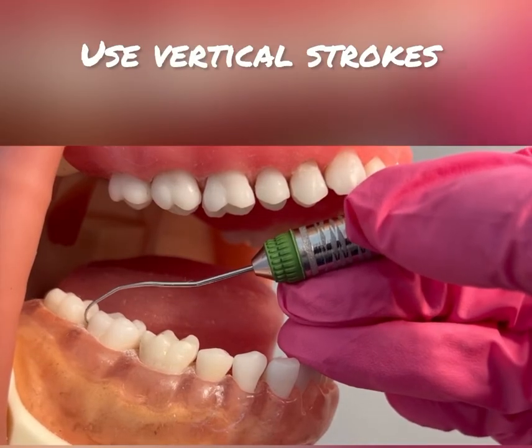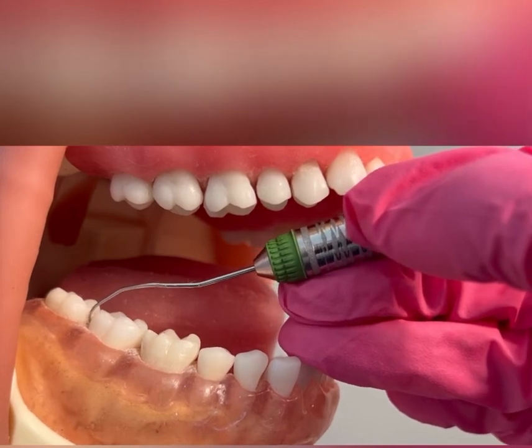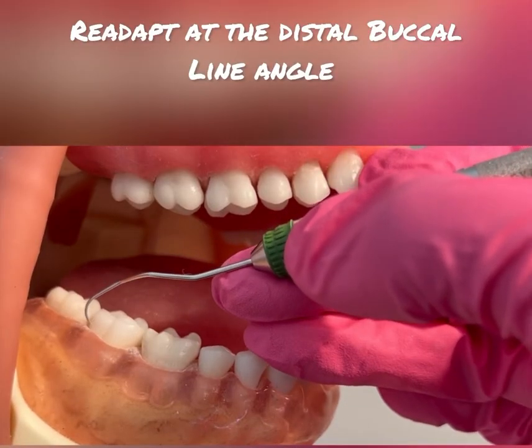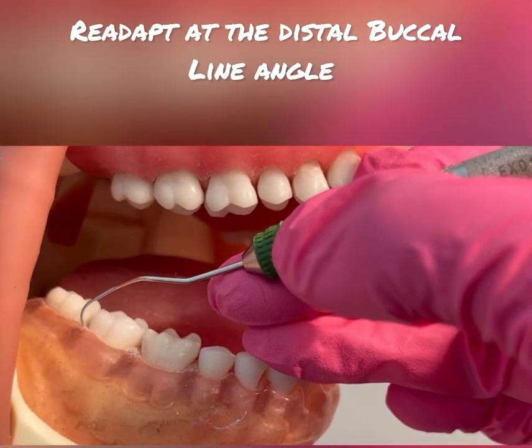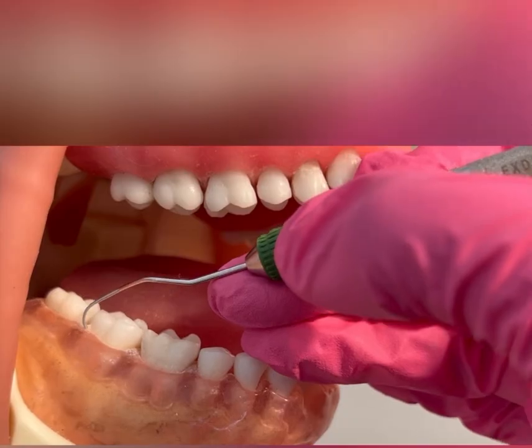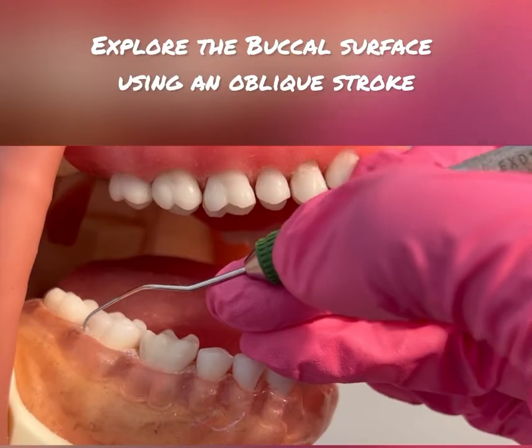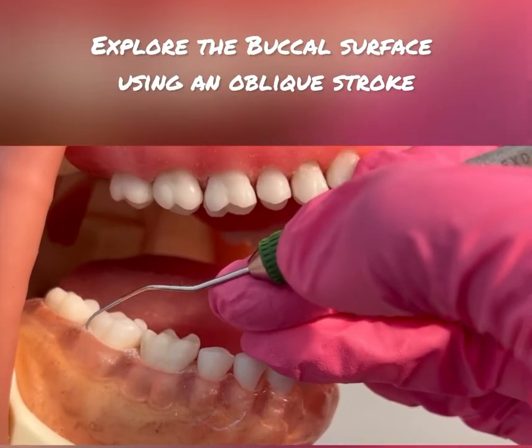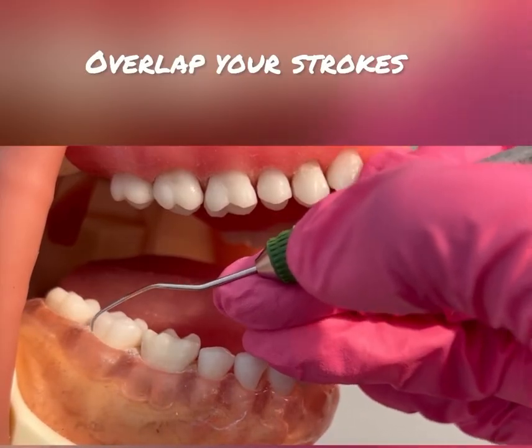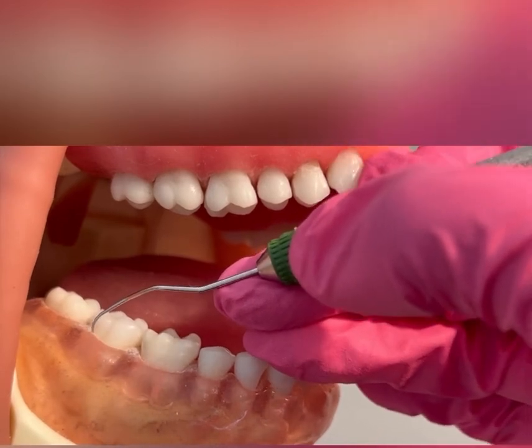Now I'm using vertical strokes going 51%, which is halfway into that distal. I'm going to come out of that pocket or sulcus. Now I'm readapting the tip third — one to two millimeters — at that distal buccal line angle. I'm coming across that buccal surface, really overlapping my strokes, using an oblique stroke which is diagonal.